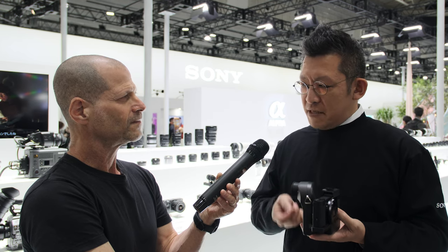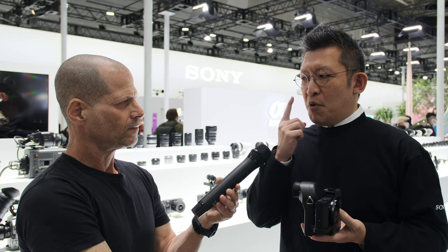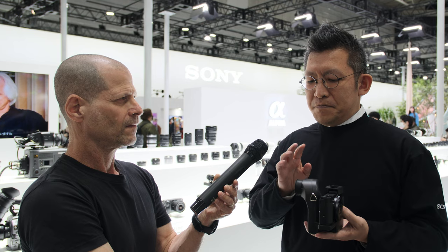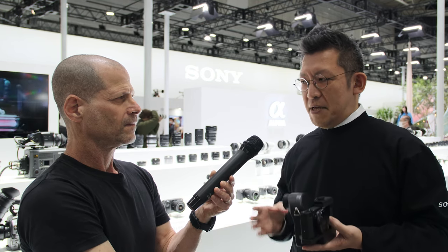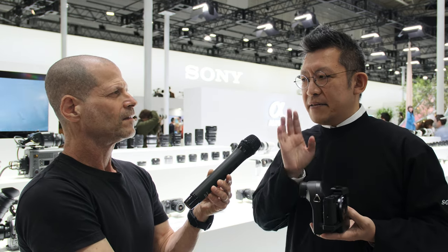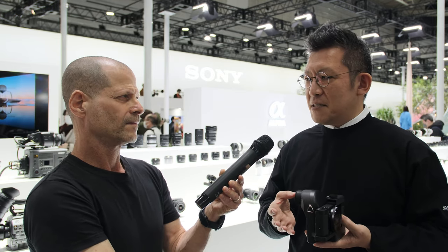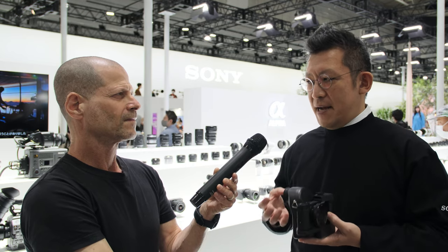By using retinal projection, we can skip the focusing function of the eye. So even if you have a lens here, it doesn't matter — it always provides a clear image to the eye.